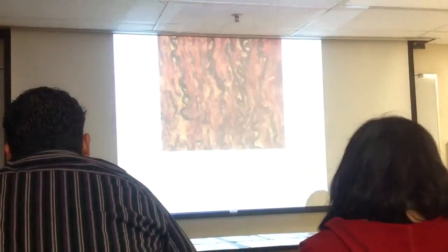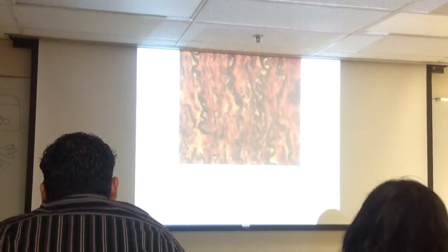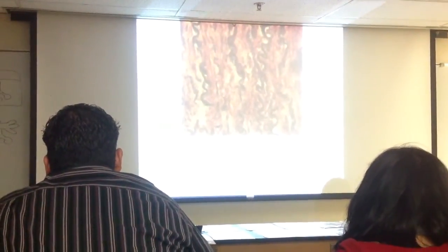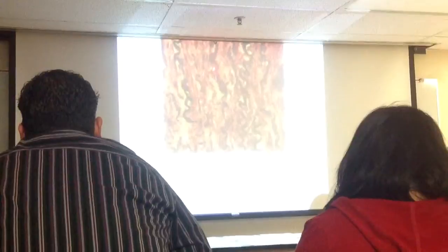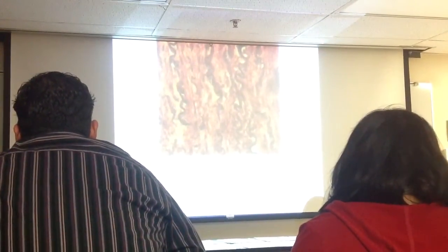What's this stuff made of? Protein. What type of tissue is this? Elastic CT. Not cartilage, just elastic CT. Organ? Artery. What's the cell called? The cells are right there. Fibrocytes. And then they produce those fibers.